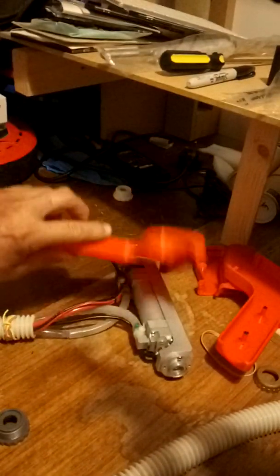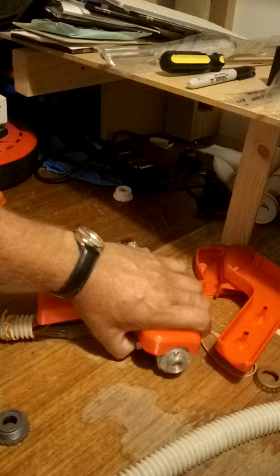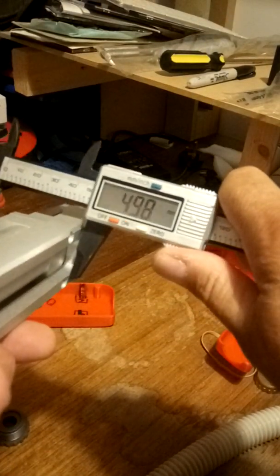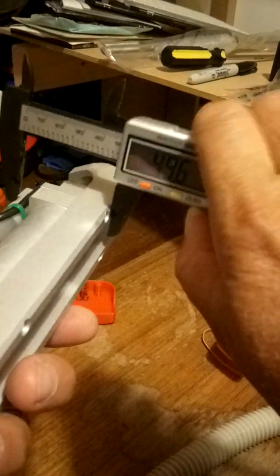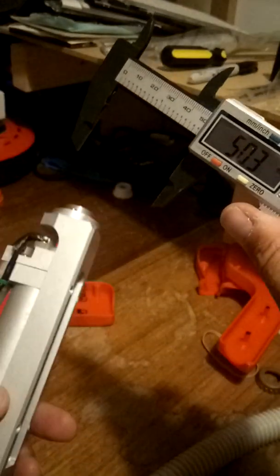So what do you think? I'll let you know as I move on when I'm going to move the A and B out of the way, them two. And hopefully this should work. So that's 53 from left to right, and this one's 49 to 50. So we're getting different readouts on this. Okay, 0.49, call it 50. So yeah, I should have 3 millimeters spare on that.